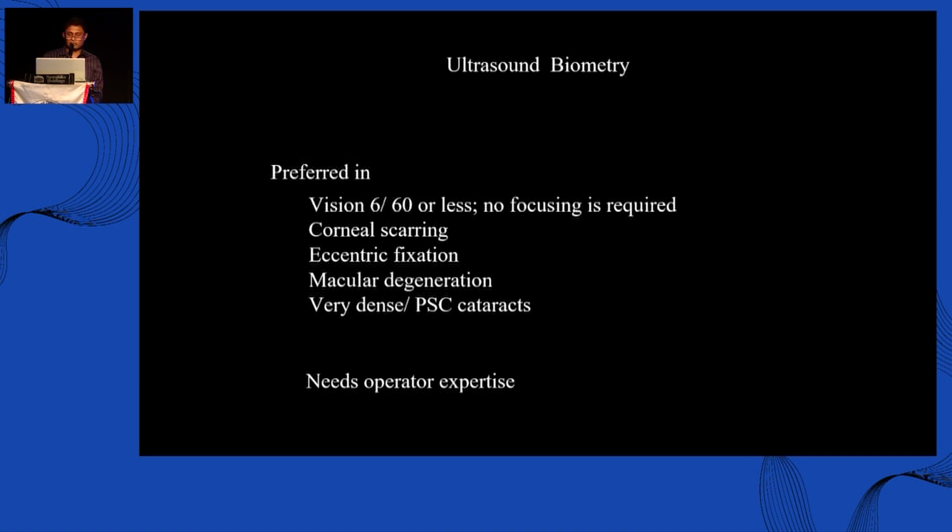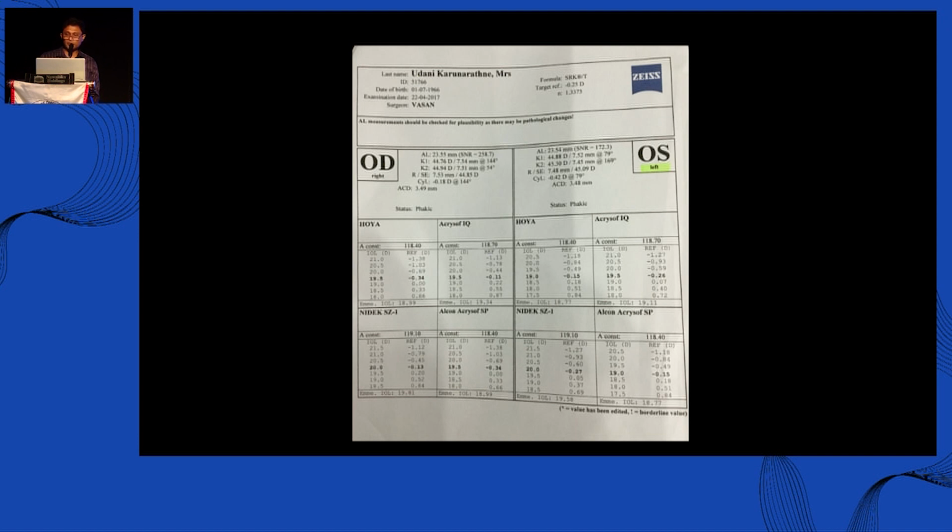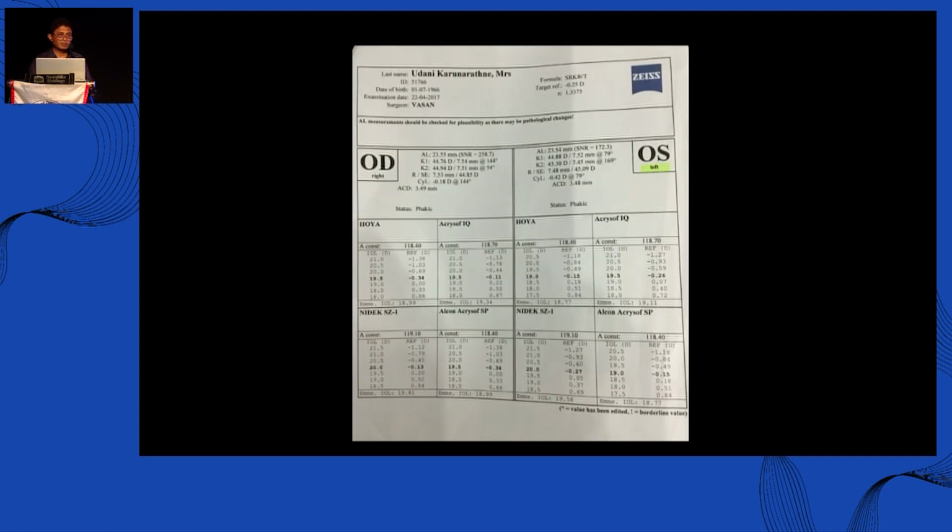Now, when possible, what I do in my practice would be, first I would ask the operator to do an ultrasound scan biometry and get the results. I would tell him to see that the spikes are correct and perpendicular, and he would do several and see whether they are all repeatable, and then get the powers. Then I would ask him to go back and do IOLMaster. So IOLMaster will tell you, it's all IOL 500. It will tell you the details.